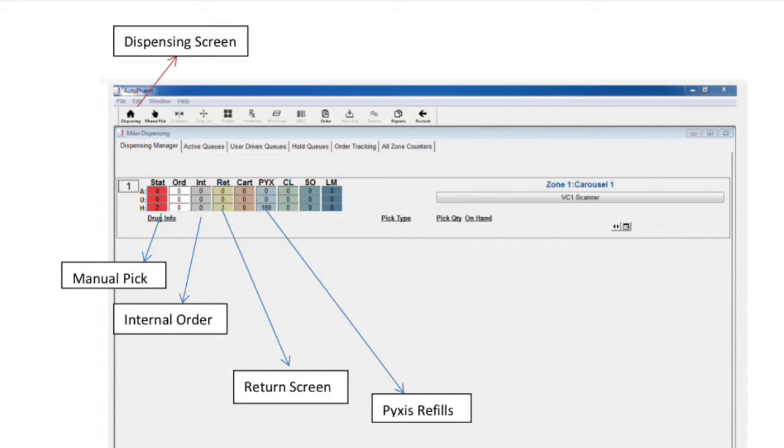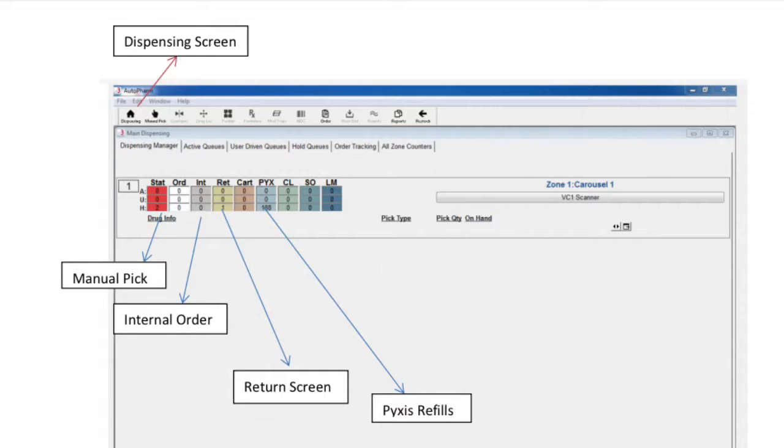The color of the line represents the type of pick. Red is a manual pick, gray is an internal order, blue is a Pixis order, taupe is a return. Currently, we do not use the other pick types. The color of the line will help the picker distinguish where the order came from.